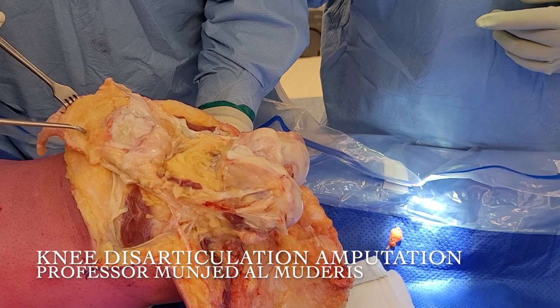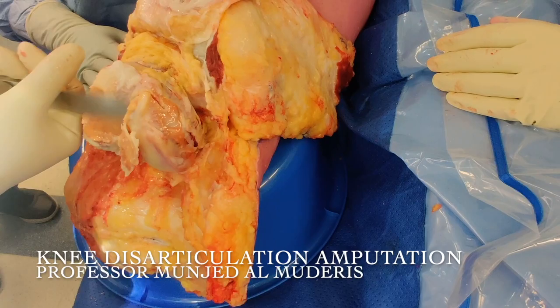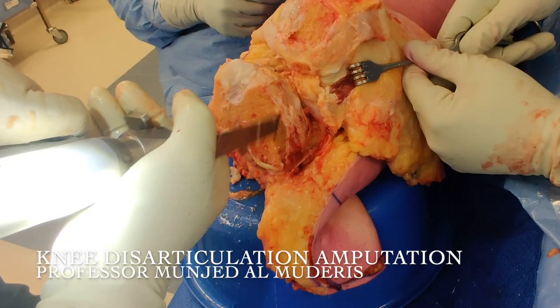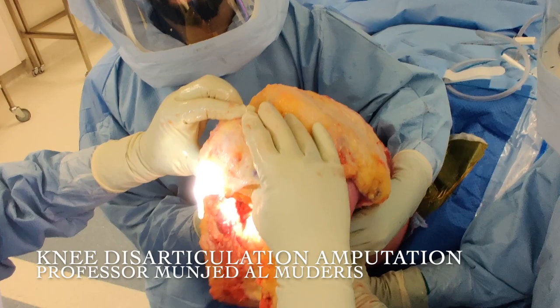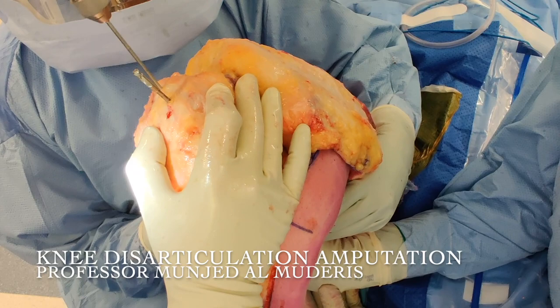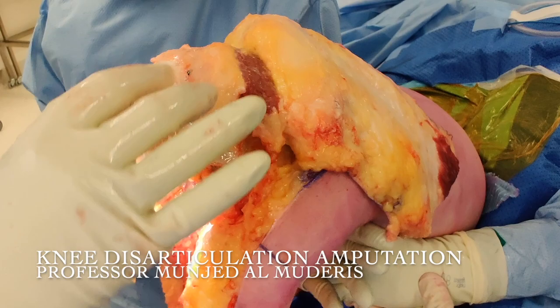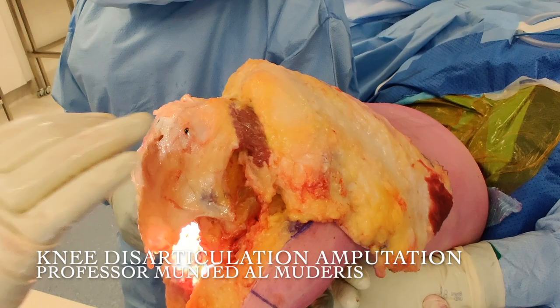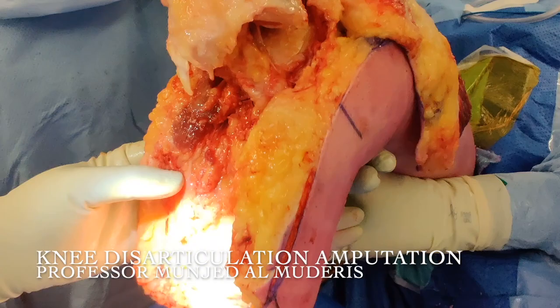This is the surface of the patella and it's severely arthritic, and that's the surface of the trochlea. The next step is to refashion the distal end of the femur in order to optimize socket-mounted prosthesis usage. I will shape the condyle and shape the patella surface as well. We bring the end of the extensor mechanism with the patella and just hold it in place over the femoral condyle. I put one central drill and two concentric drills. I've buried the screw head — that's why I chose locking screws in this case. You can use headless compression screws as well, but these are acting as strong bolts. Now I'll reconstruct the flexor mechanism of the knee to the extensor mechanism of the patella tendons.